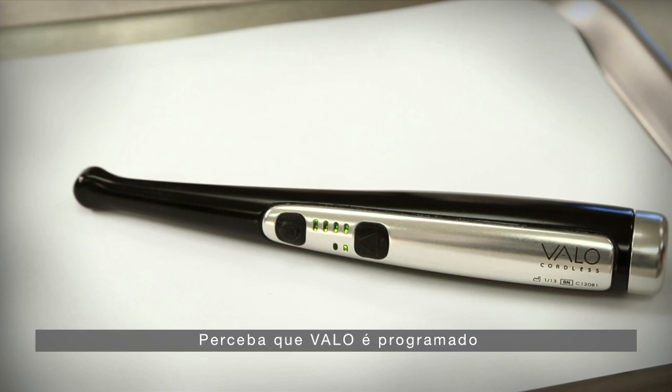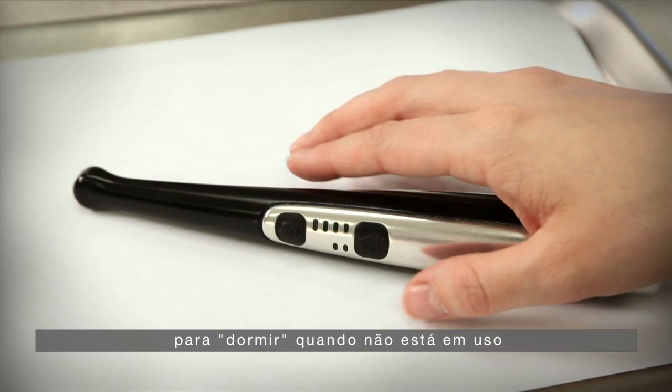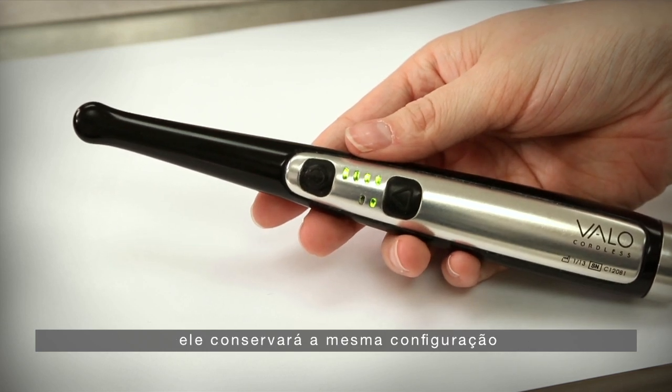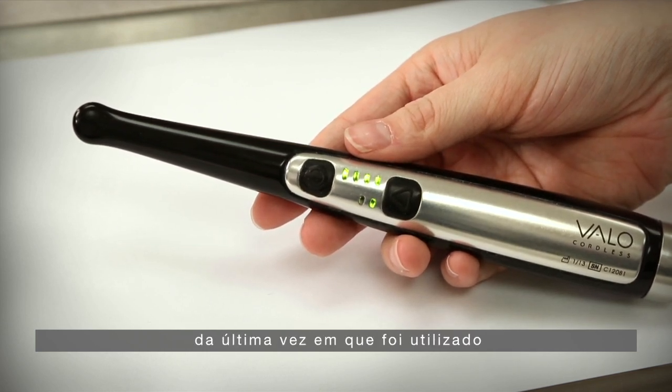Please note, the VALO is designed to go to sleep when not in use. When you are ready to use the VALO again, it will remain with the same settings as when it was last used.